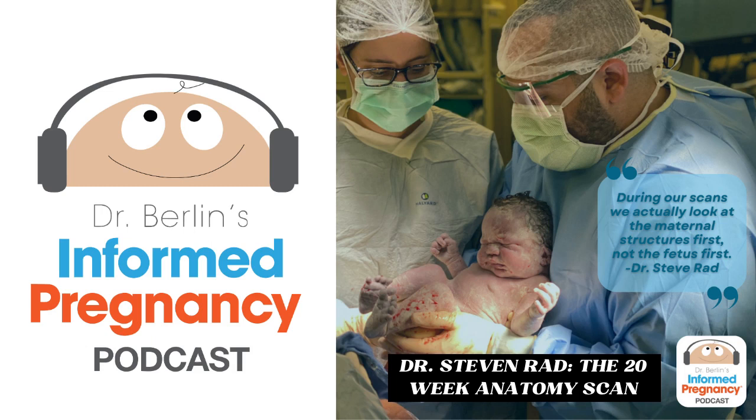And if we need their bladder to be full, it fills pretty fast, as oftentimes people need to even take a break in the middle. So we just have them empty their bladder from the beginning. I think most centers, back in olden times, would tell you, oh, drink a bunch of water before you come. And maybe some centers still have those rules, but pregnant women's bladders fill pretty quickly.